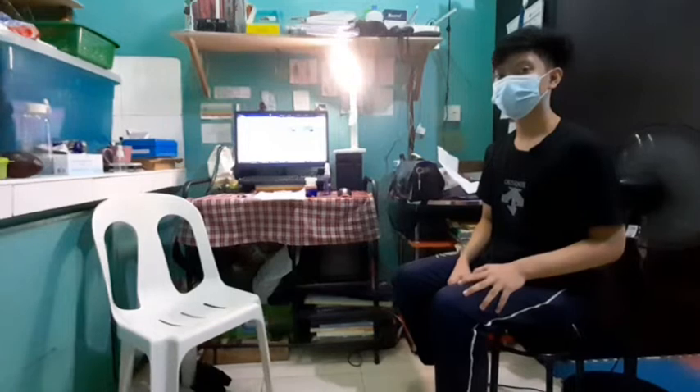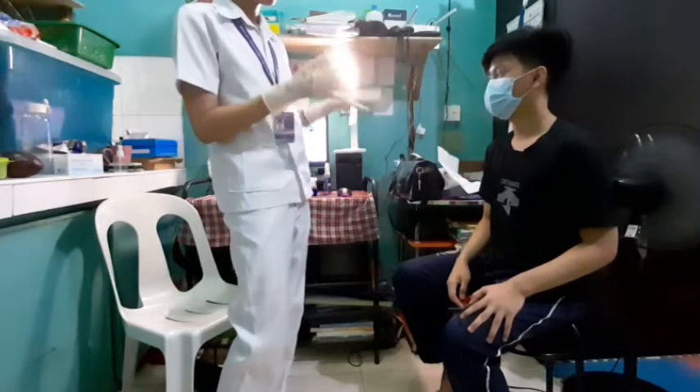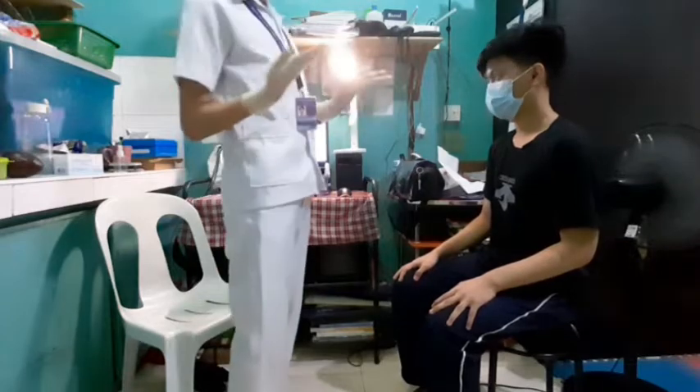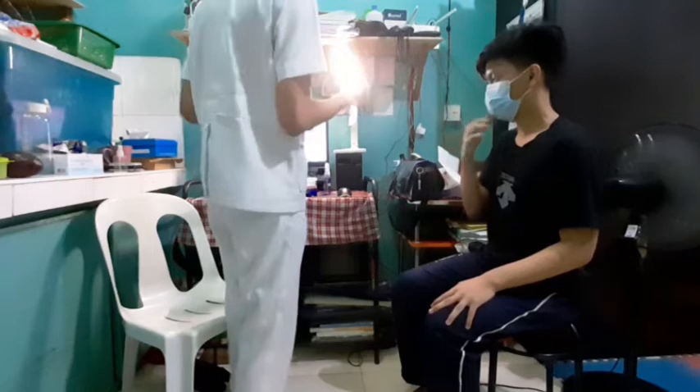I'm done with my medical hand washing and have also put on my gloves. This creates a barrier between my skin and the client's skin to deter the spread of microorganisms and infectious diseases. I will now provide the client's privacy by closing the door if the patient is in a private room, or sliding the curtains if the patient is in a ward. I'll close the door now. Now I will position the client for the assessment. He can sit properly, so I'll just need him to sit properly. Can you please sit properly?